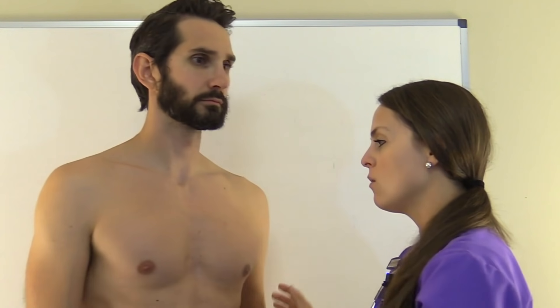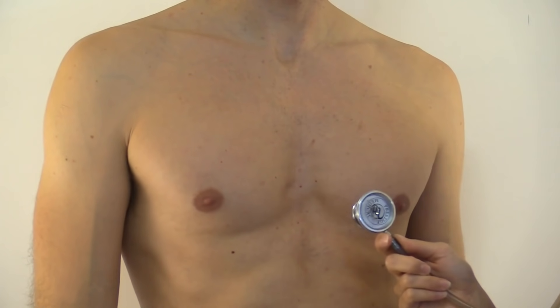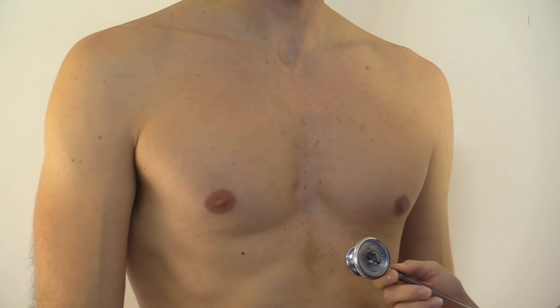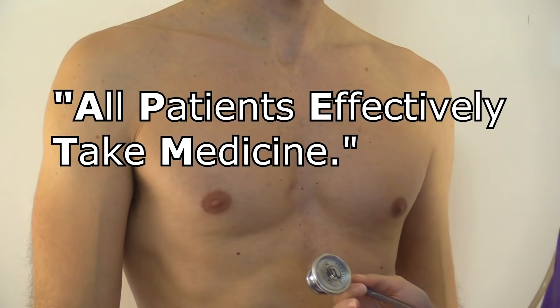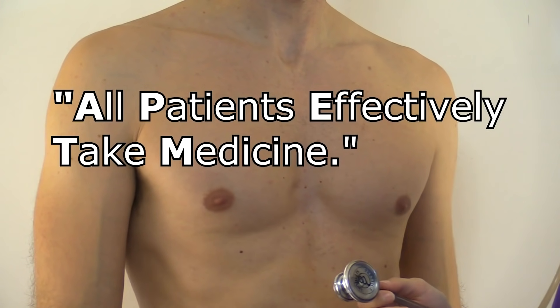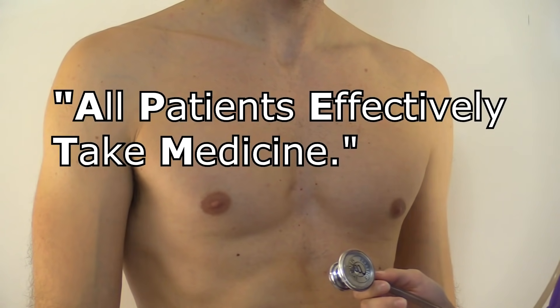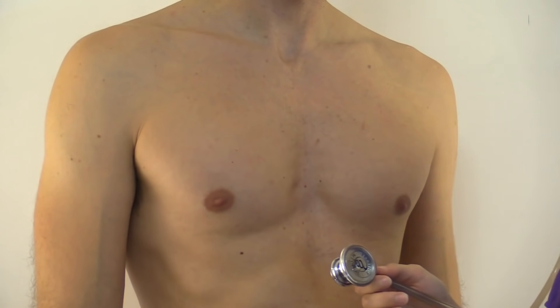Now we're going to listen to heart sounds and then lung sounds. First, let's auscultate heart sounds. We're going to do this in five locations based on where the valves are located. I like to remember the mnemonic: 'all patients effectively take medicine.' The first letter of each word represents the valve, except for 'effectively.'